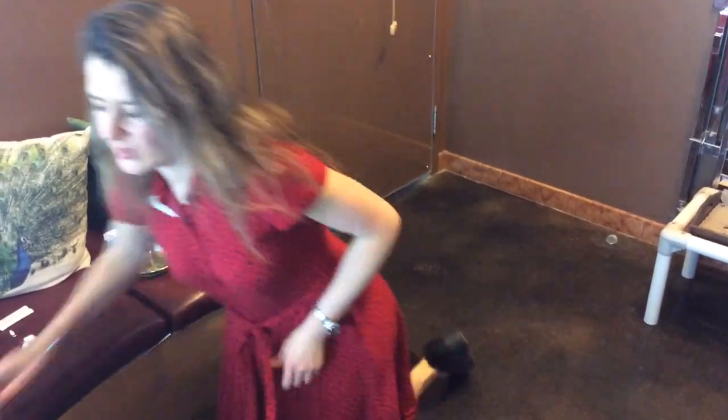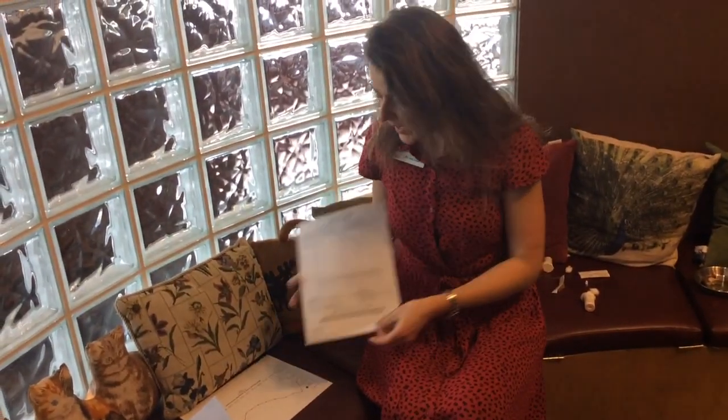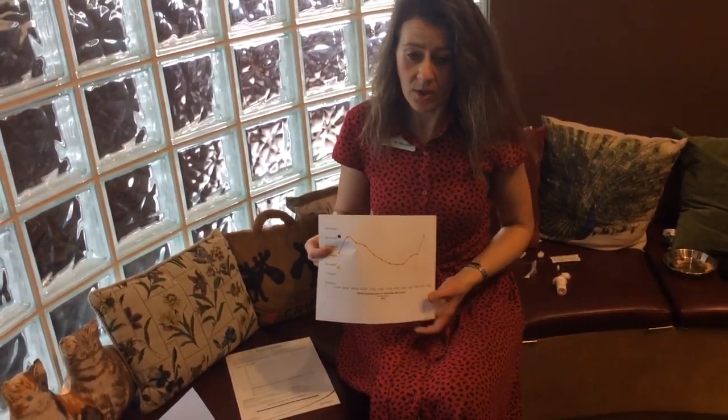Then you mark down the result. Your veterinarian will provide you with a chart, or there are now apps where you can record the numbers. With some really nice software you can put the data into a computer system and it will show you the glucose curve.